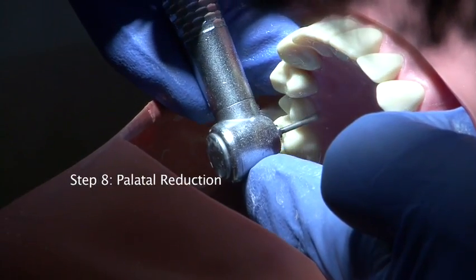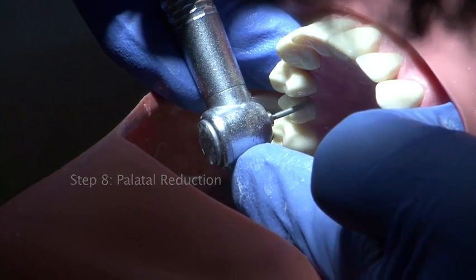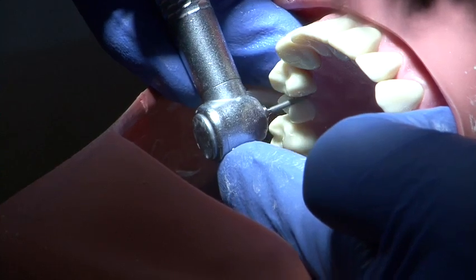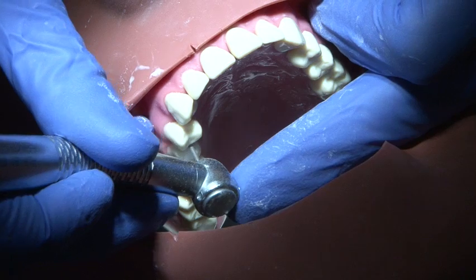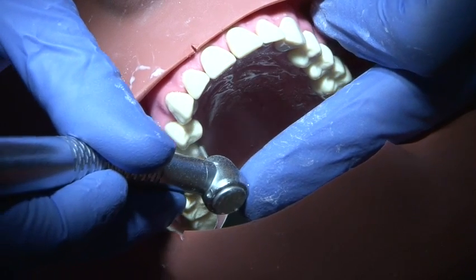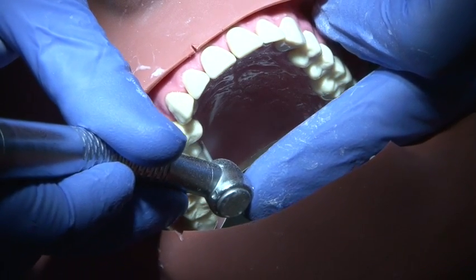The palatal surface of the crown is usually finished using metal alone, so the degree of reduction is in the order of 0.7 to 1mm. A chamfer margin is achieved using a round ended medium grit parallel sided burr.